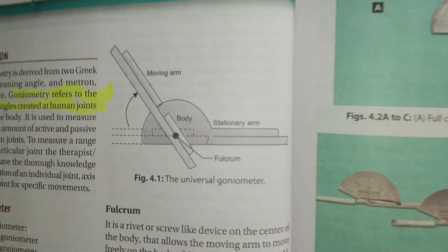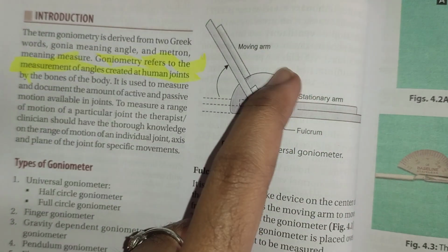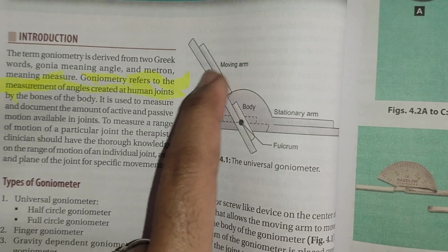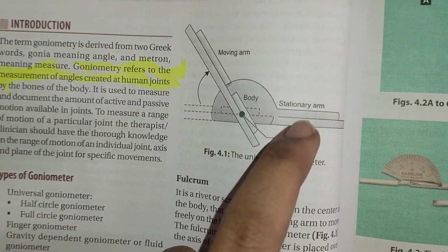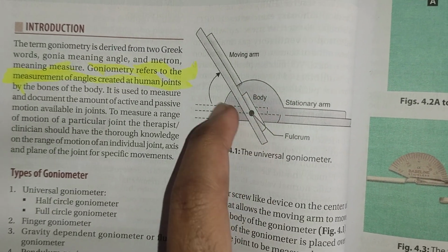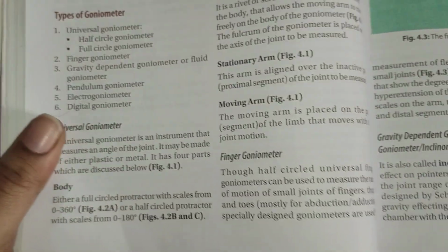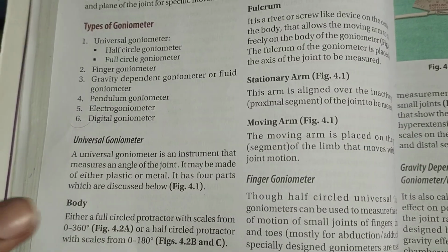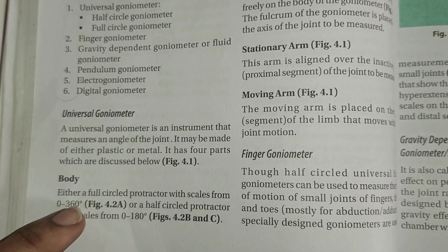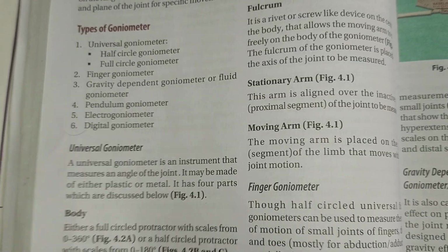We see this is the goniometer. This is the universal goniometer I am showing. So this is 180 degrees only. If it is 360 degrees, it will be a full circle like the protractor. The protractor is also 360, but we take this 180 degrees. So the body is either a full circled protractor with scales from 0 to 360 degrees or a half circled protractor with scales from 0 to 180 degrees.